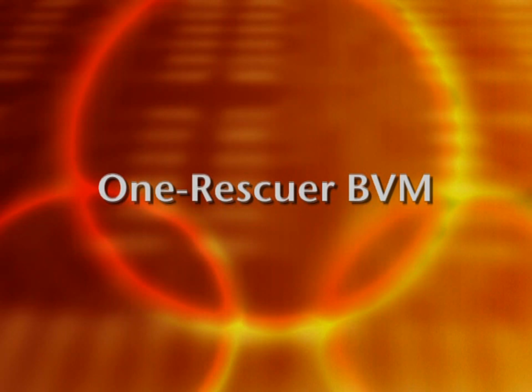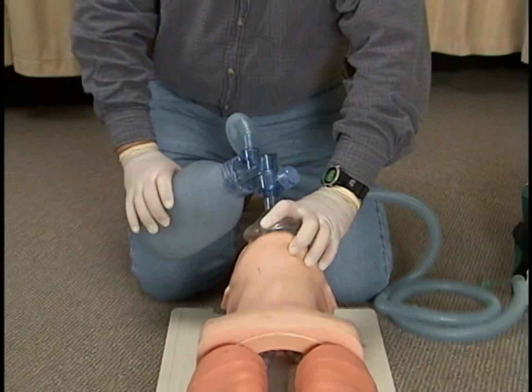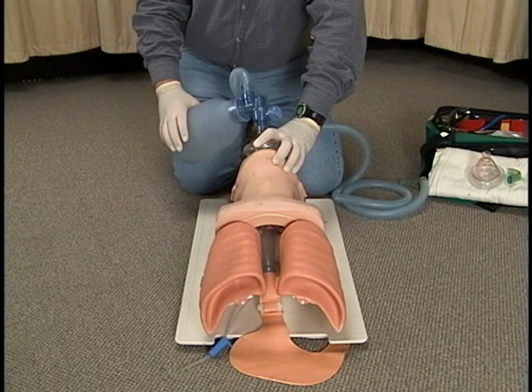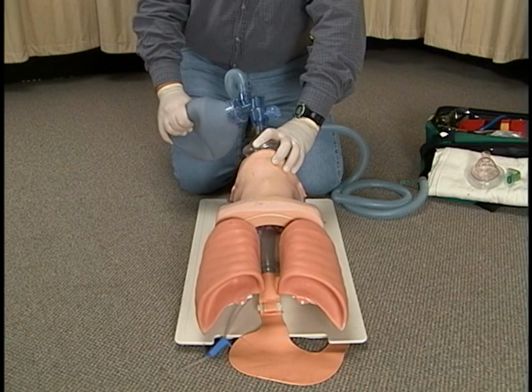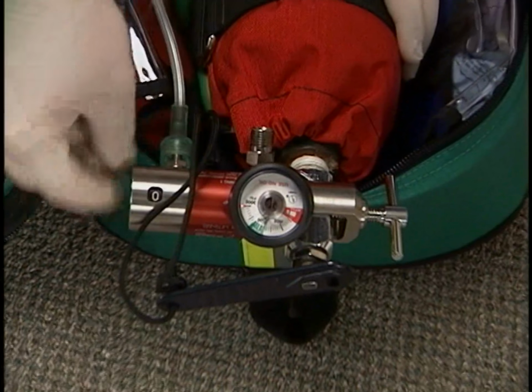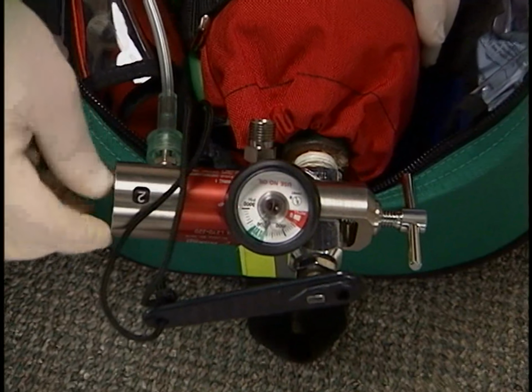With the airway open and the mask properly applied to the face, begin ventilating the mannequin. Note the proper expansion of the lungs, indicating adequate volume. Attach the reservoir to supplemental oxygen and adjust the liter flow to at least 15 liters per minute.